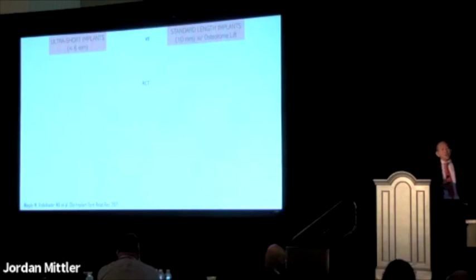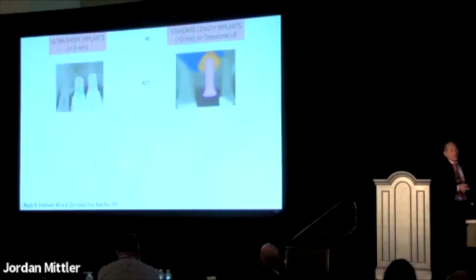Well, that's very interesting. How about grafting? Comparing an ultra short implant, meaning nowadays short implant is not 8 anymore. Ultra short is less than 6, and short is defined as 6 to 8. So what they did is they compared an ultra short implant to doing an osteotome sinus lift with a 10 millimeter implant. There's a randomized control study also.